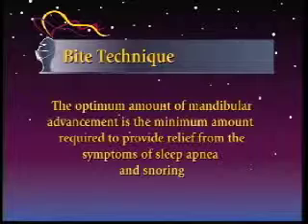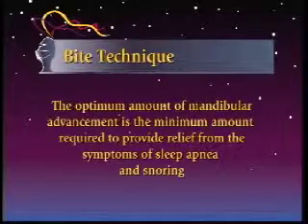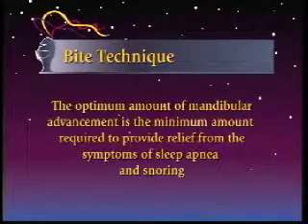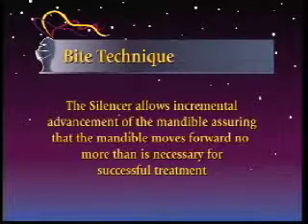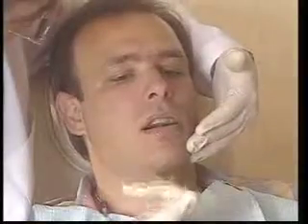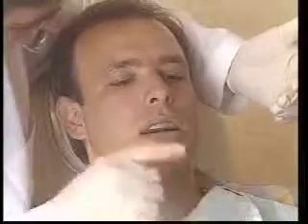The optimum amount of advancement is the minimum amount required to provide relief from the symptoms of sleep apnea and snoring. The silencer allows incremental advancement of the mandible, assuring that the mandible moves forward no more than is necessary for successful treatment. The role of the silencer bite technique is to take advantage of the appliance's unique features to provide maximum flexibility and comfort for the patient.